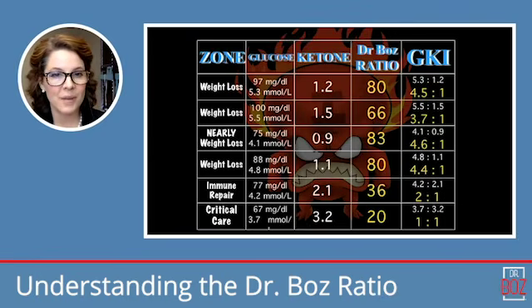So here was this patient's blood sugar at 97. In America, that would be 97 milligrams per deciliter, but the rest of the world measures millimoles per liter, so the ratio is converted. A 97 blood sugar was a 5.3 on the other scale. The ketone numbers, everybody measures with the same units.